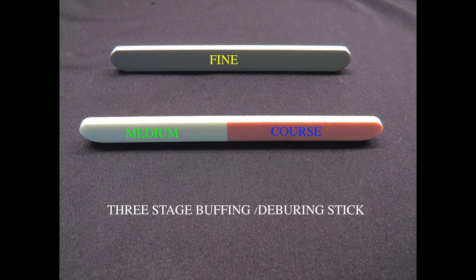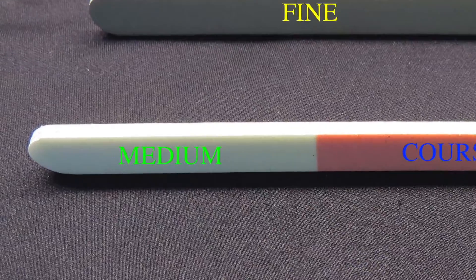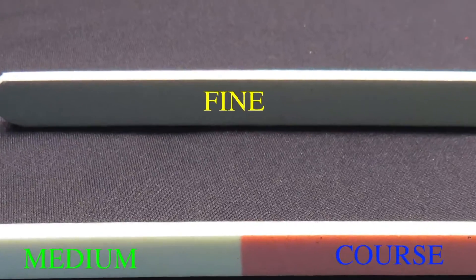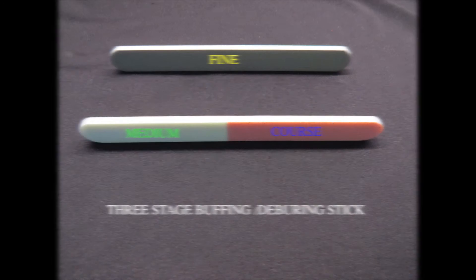Three Stage Buffing Deburring Stick: This tool has three buffing surfaces and is used to restore the finish on stainless instruments. It has three grits: pink is coarse, white is medium, and gray is fine. The three stages of polishing are used to restore the finish to the points of instruments after reshaping with the point file. It can also be used to remove scratches that may affect instrument function.